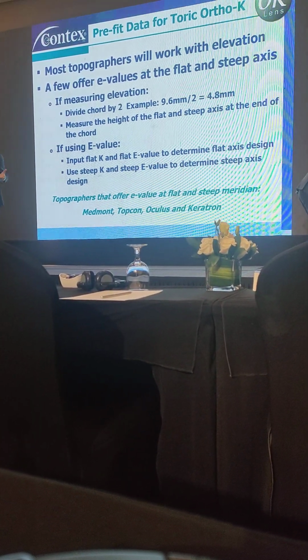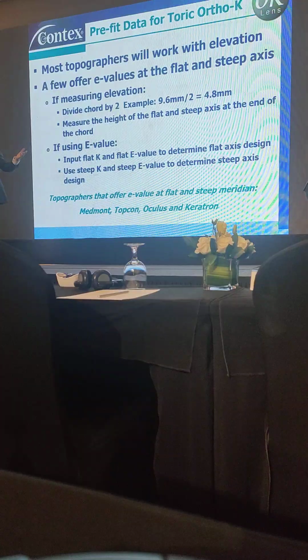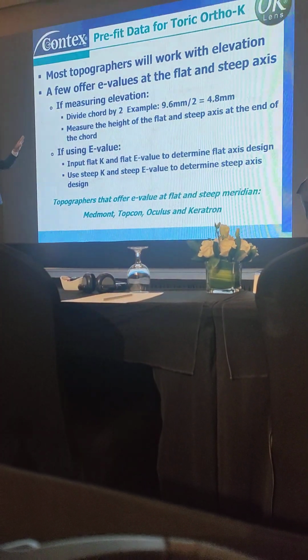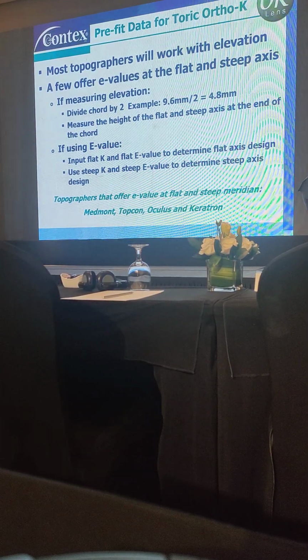And I have to throw out another plug for the Medmont topographer, because it allows us to get the elevation at any diameter.